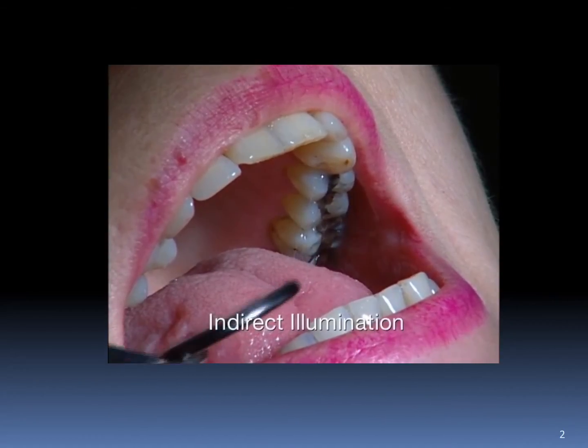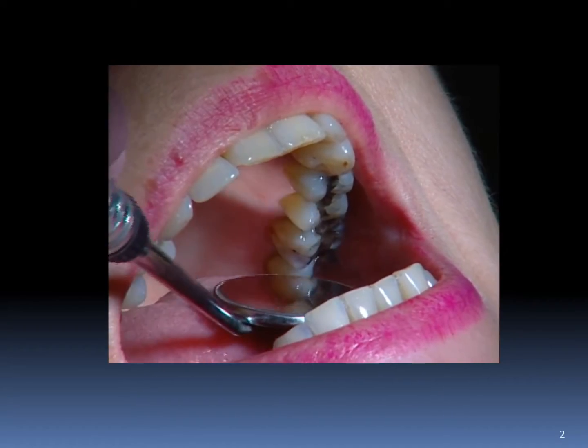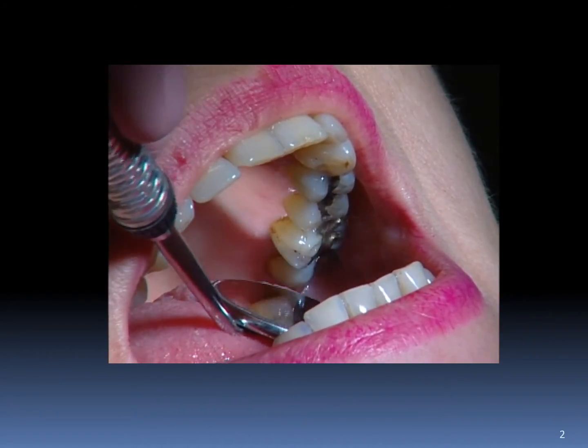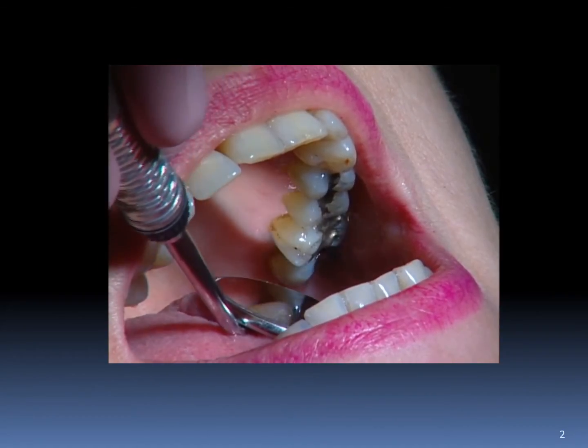Indirect illumination is the use of the mirror surface to reflect light onto a tooth surface in a dark area of the mouth. Here, a mirror is used to direct additional light onto the lingual surfaces of the maxillary left posterior teeth.